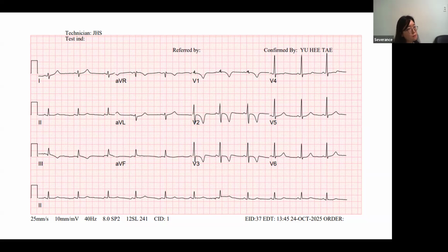I saw the same thing when I was junior faculty, and I realized it is easier to rotate the unipolar catheter a little bit to the atrial side, avoiding the contact problem. Then the U-shaped curve ablation is better and easier.